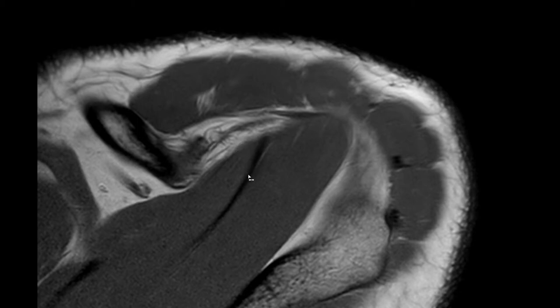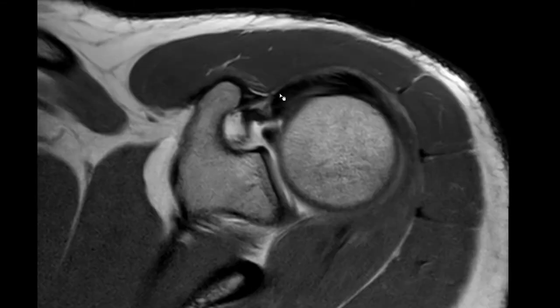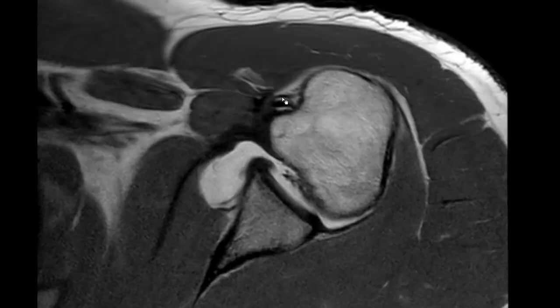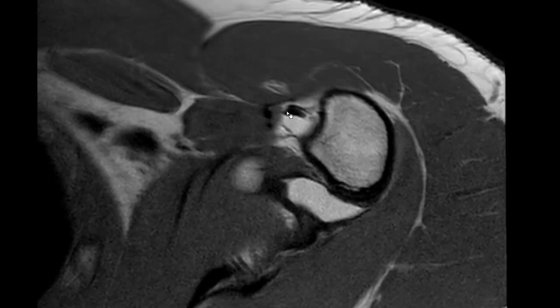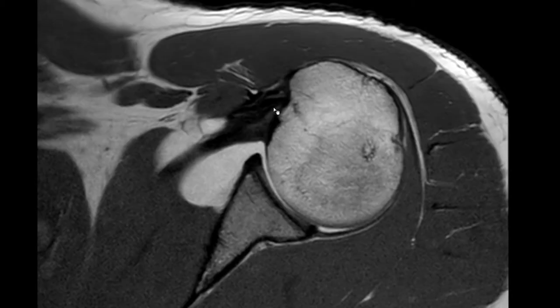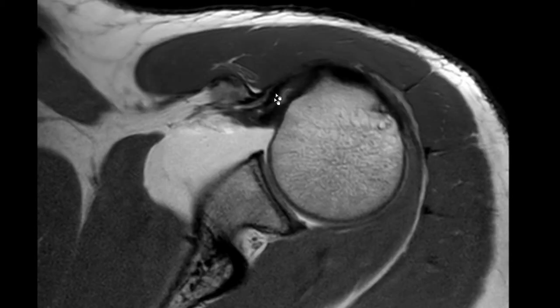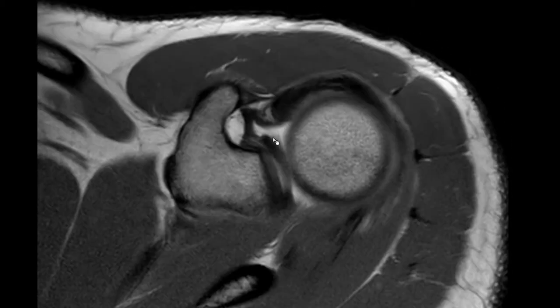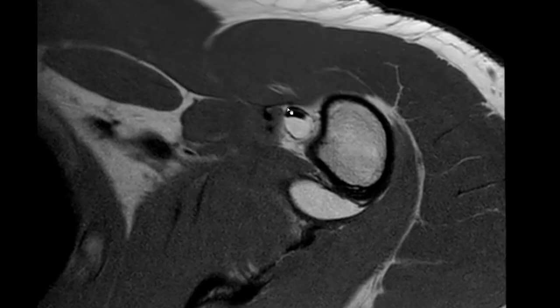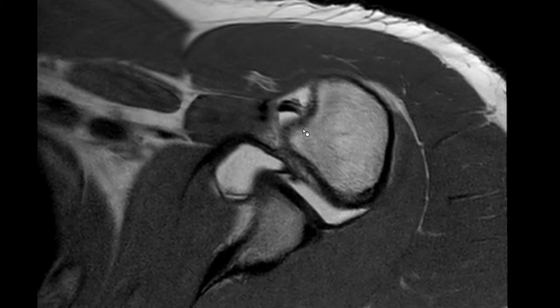Let me show you this again. This is the supraspinatus tendon, and you have this structure here running into it. This is the biceps tendon below it. This is the aponeurotic expansion, and this is the biceps tendon. The expansion runs alongside the biceps tendon through multiple slices. So it's not a split — it's just a normal finding. I would say it's not even a variant; it's just a normal finding.